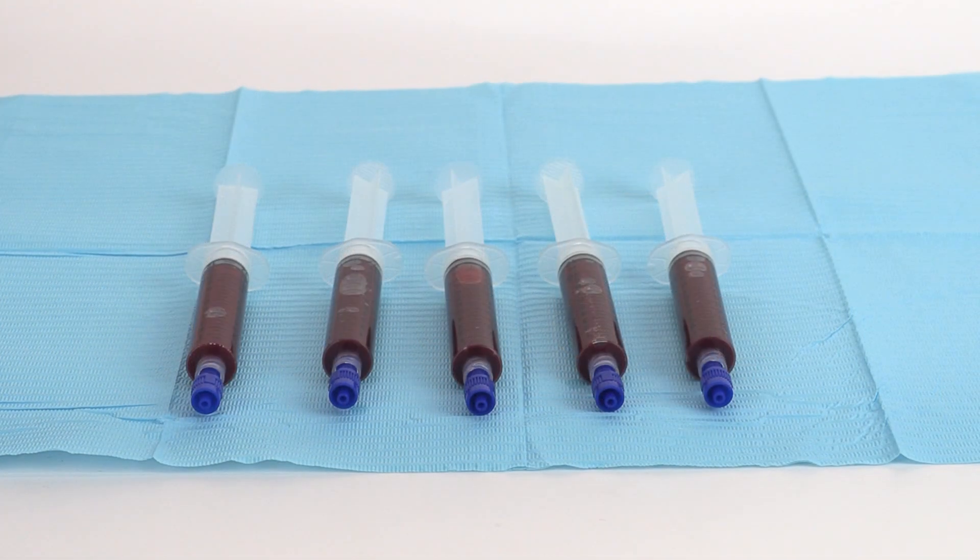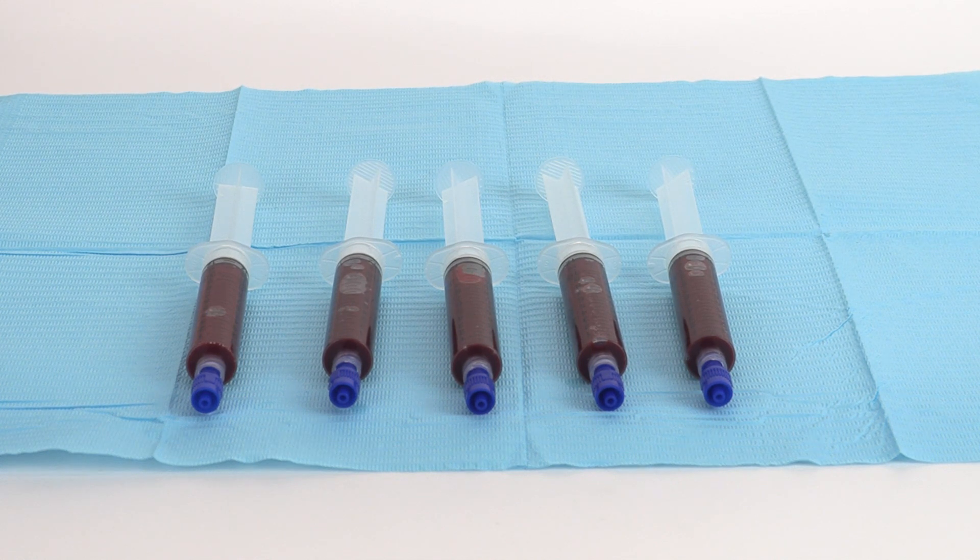Using standard technique, aspirate 11 milliliters of bone marrow aspirate into each 12 milliliter heparinized syringe, filling five syringes to 12 milliliters.